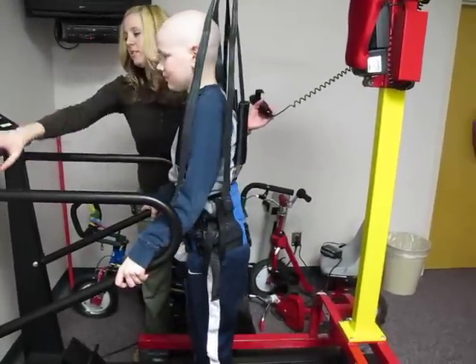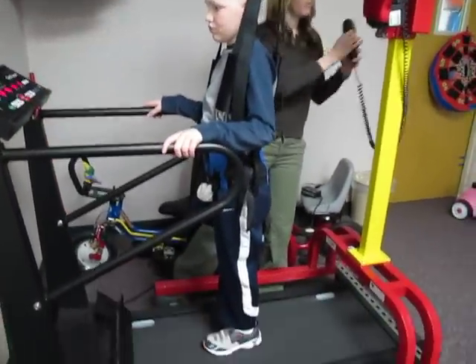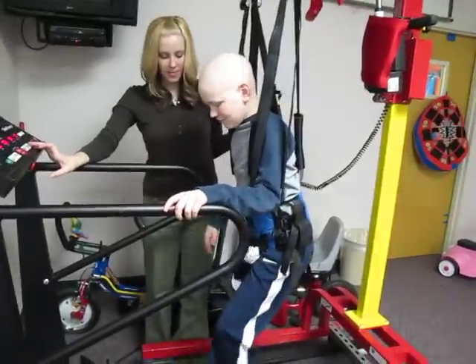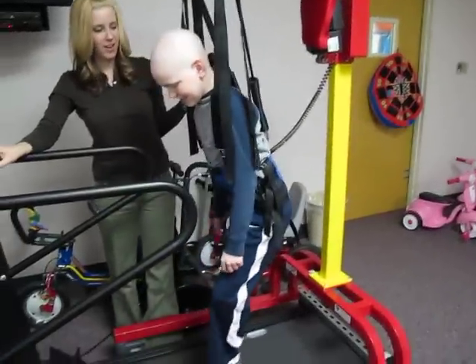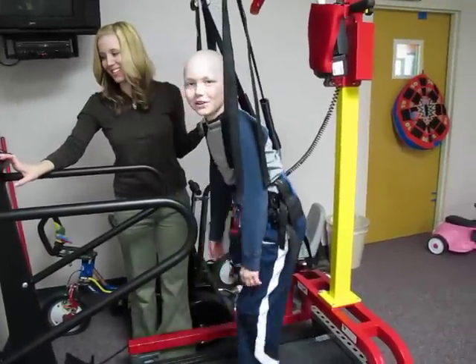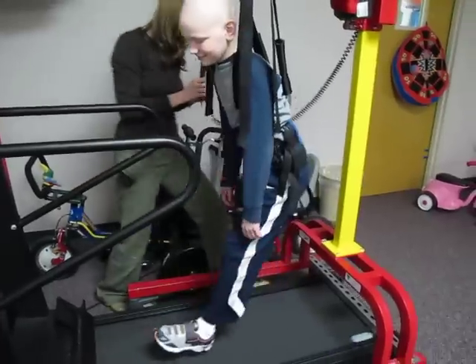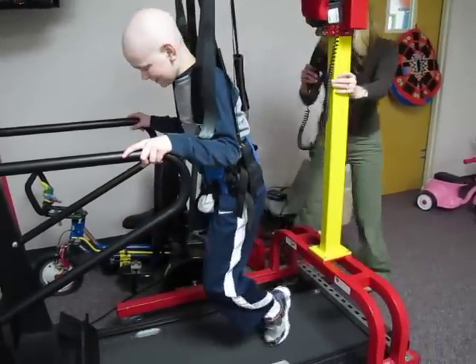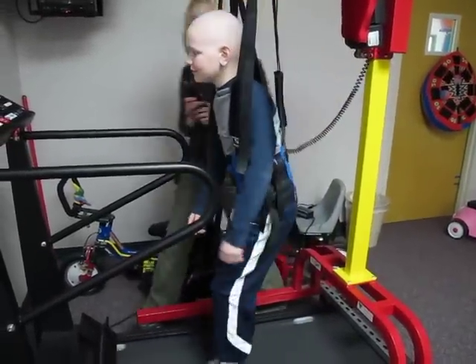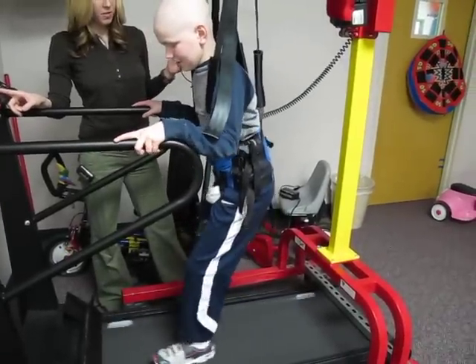So today is kind of just like a trial run — they're going to let you figure out what this feels like. And we'll do the treadmill. There you go. You want to go really fast? You're walking really slow. Are you videotaping? This will be so neat when you get your leg on. You can keep your hands on those bars if you want to. Let's go fast. You want to go fast?